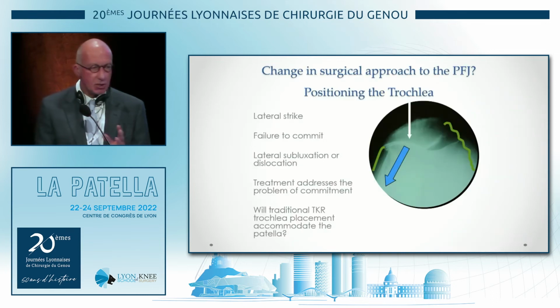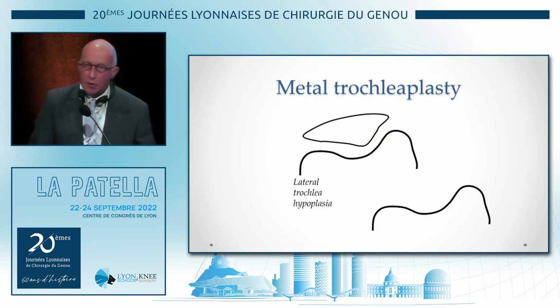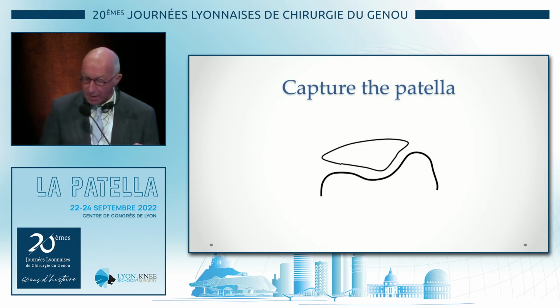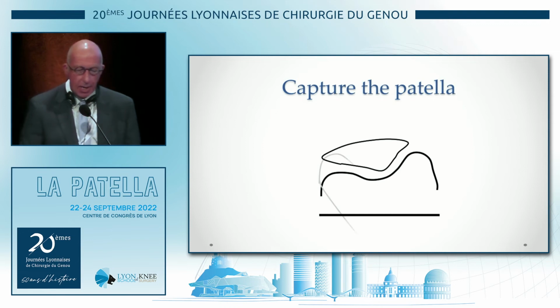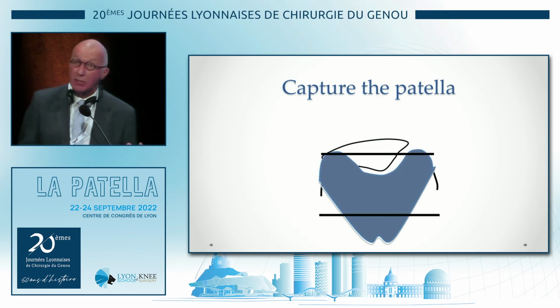Okay, and so we've changed our positioning of the trochlear, and you heard Seb talk about that, because before we talked about a metal trochleoplasty, and even some people in this meeting have talked about that. And they say, okay, there's a hypoplasia, so we have to correct that to make our X-ray look better, and so they talk about capturing the patella. Okay, and so they would say, I put my implant in like this because it looks better on the skyline view, and that's how I do a total.